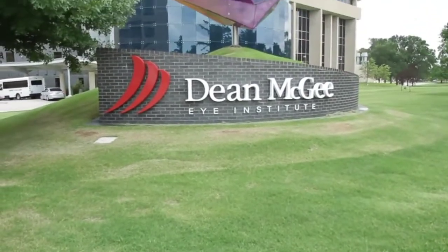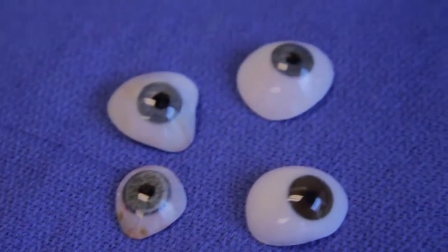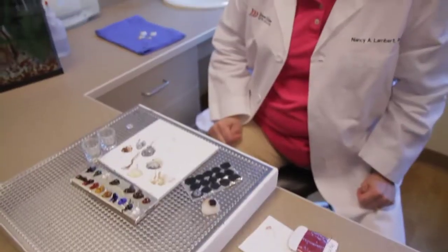It's a one-day process. They're in and out of my office four times during that day. It takes me about six or seven hours to make an eye. We're very much a handcraft.